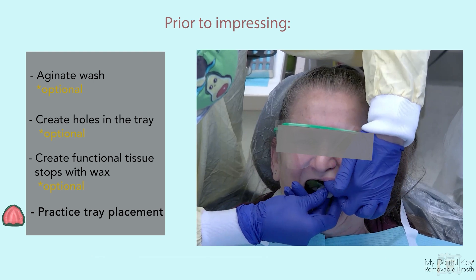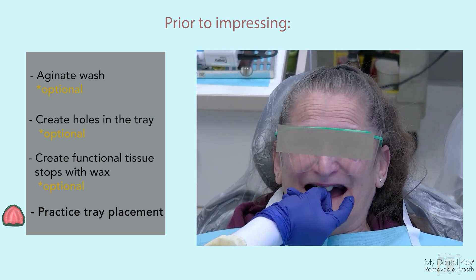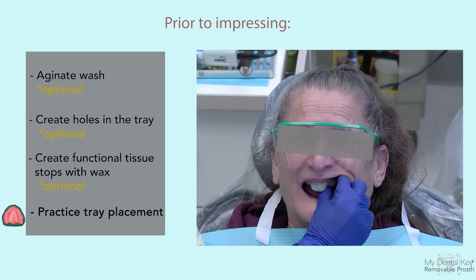Practice seating and removal of the tray with the patient prior to making the final impression. Ensure that there is adequate retention from the border-molded tray alone without the addition of impression material before proceeding to the final impression.